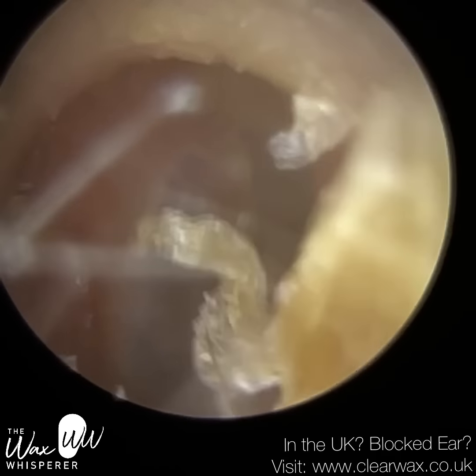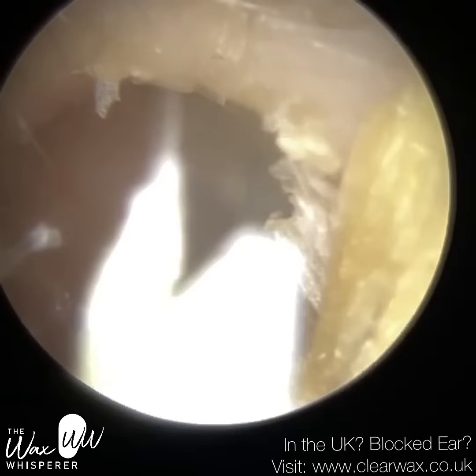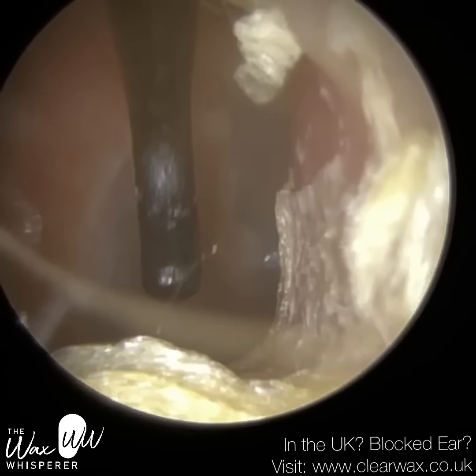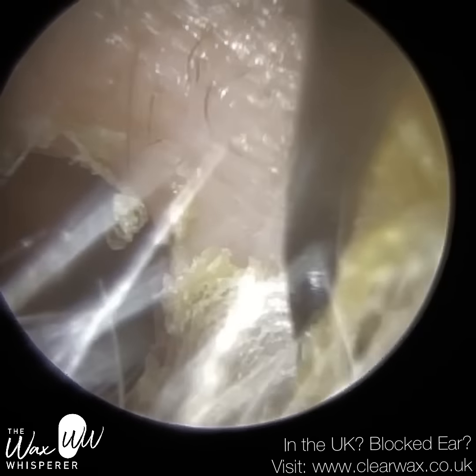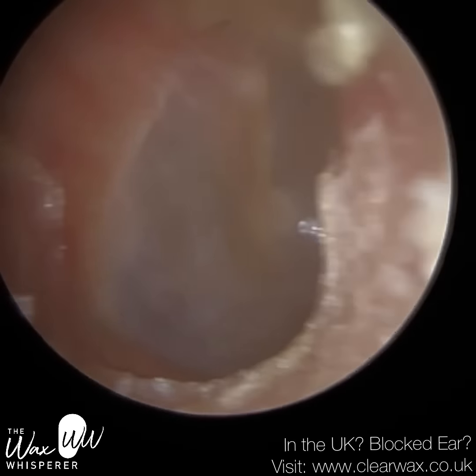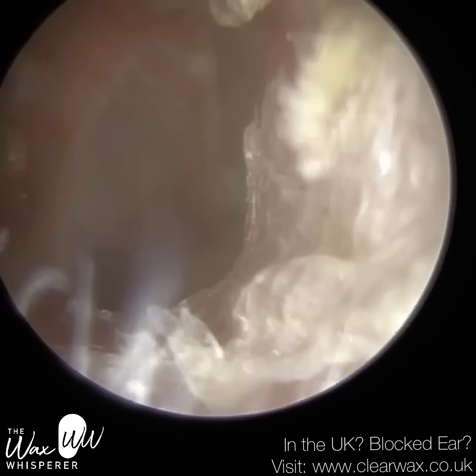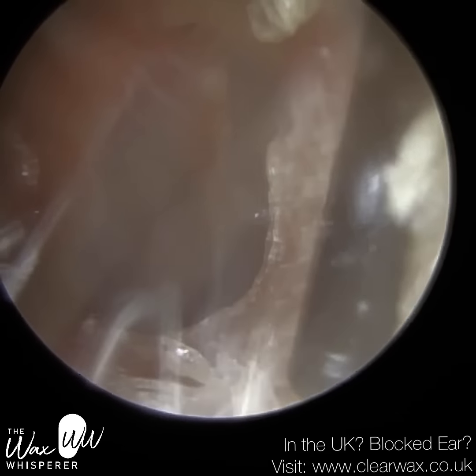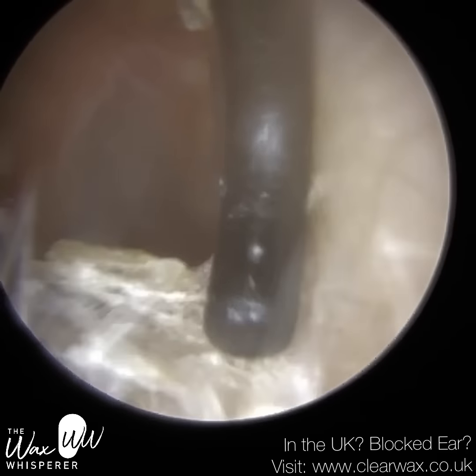You do have to be careful when you use a hook because the tip, although it's somewhat blunted and rounded, can cause severe trauma to the ear canal if you embed the hook too deep or you fail to move it away from the side ear canal walls. You can graze or cut the canal wall, cause bruising, bleeding, and obviously severe pain, possibly even leading to infection. So whenever you're using a hook or Jobson Horne or forceps or any instrument really, you want to try and avoid digging into the canal wall and causing trauma.